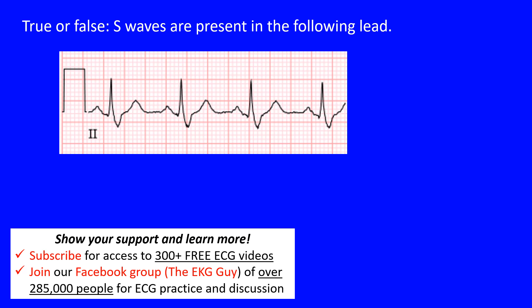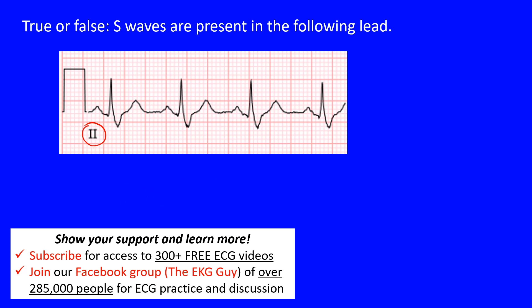Here we have a true or false question: are S waves present in the following lead? We have Lead II here, which is one of our inferior limb leads. Remember there are six limb leads and six precordial leads. Lead II is one of the three inferior leads — the other two are leads aVF and Lead III.